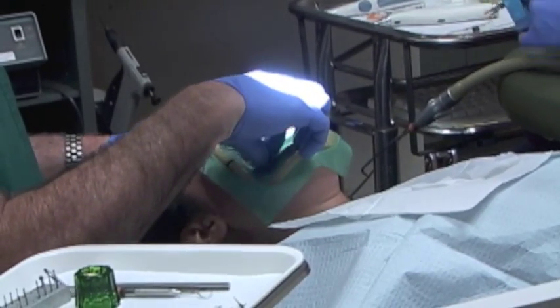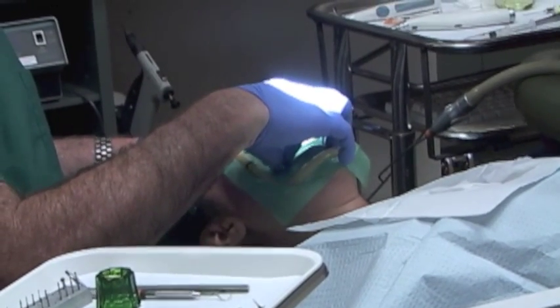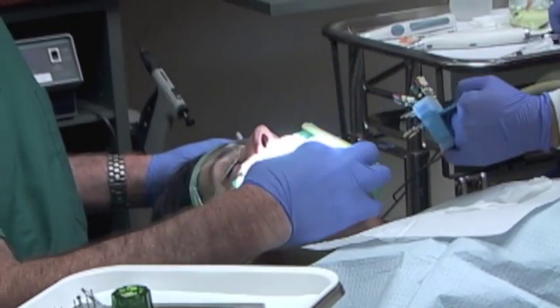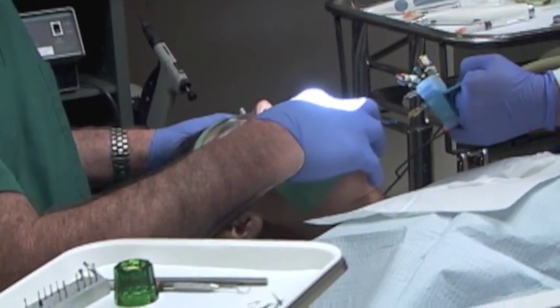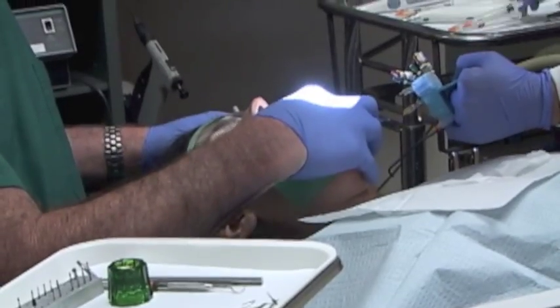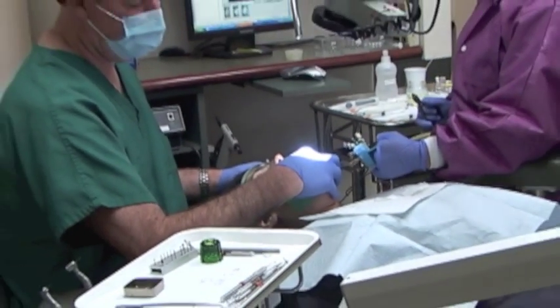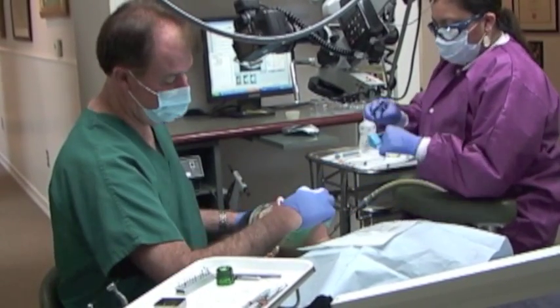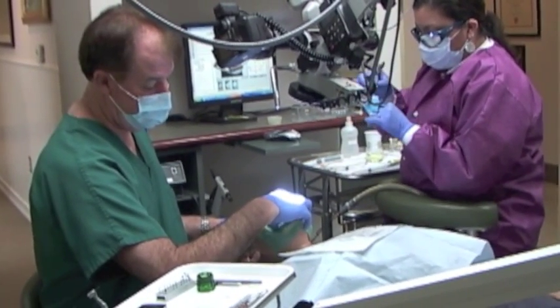Because I have really nice line angles where the canal will just slip right down the line angle on the canal, I don't really need the scope during this part as I'm getting myself in a comfortable position to smooth out the bump. We pretty much almost have it shaped out now. I'm kind of leaning the file along the mesio-lingual groove and filing that as well, kind of opening that up. Passive movement, sliding the file down.